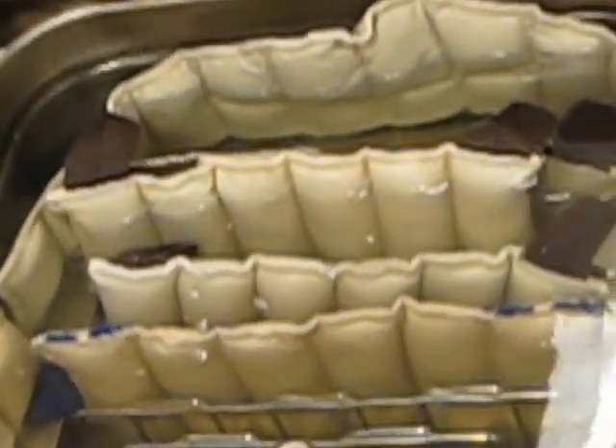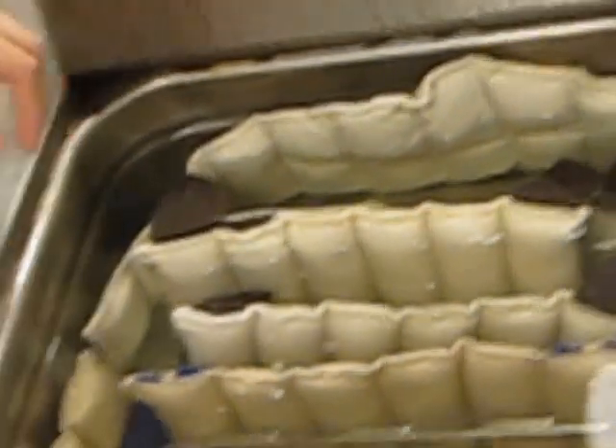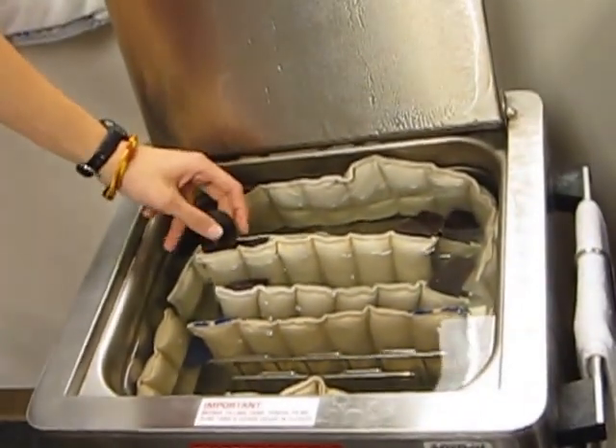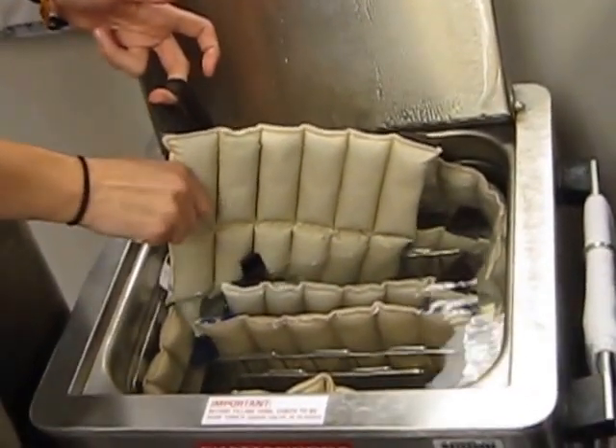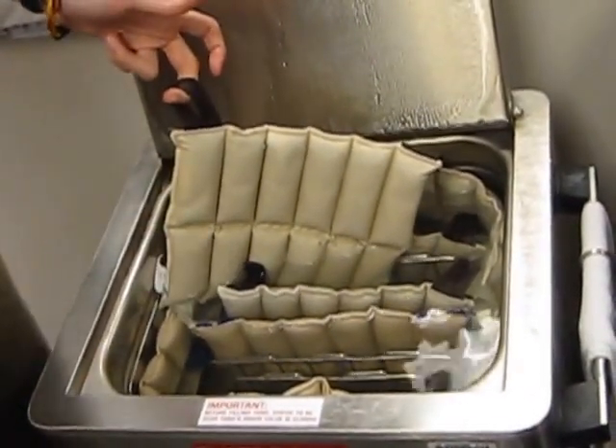As you can see, they are placed in water. The temperature of the water is approximately 160 degrees. The hot packs are made of a canvas material that has a silicone gel inside, which retains the heat very well.